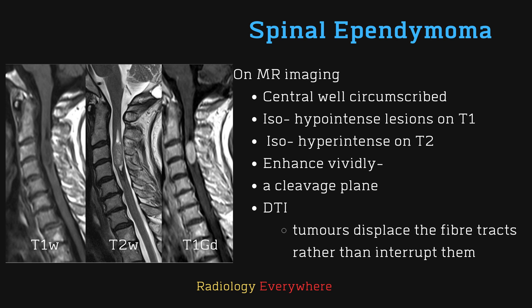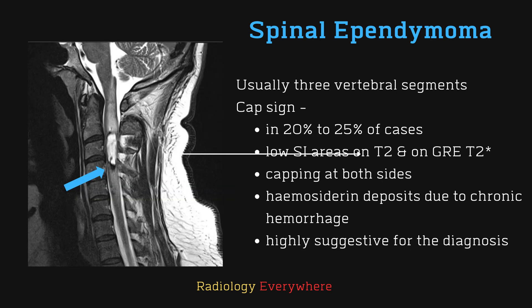These are usually well defined, which allows total removal of the tumor in most cases, as they are mainly compressed rather than infiltrating. We can see a cleavage plane. Occasionally, DTI may show fiber track displacement rather than interruption. The mean size of ependymoma is usually within three vertebral segments, whereas astrocytoma is typically very extensive.